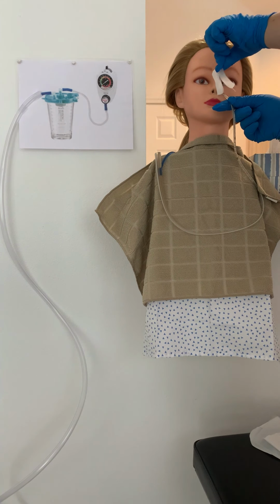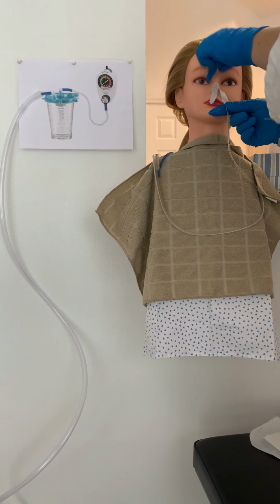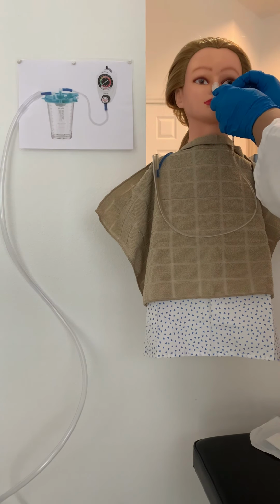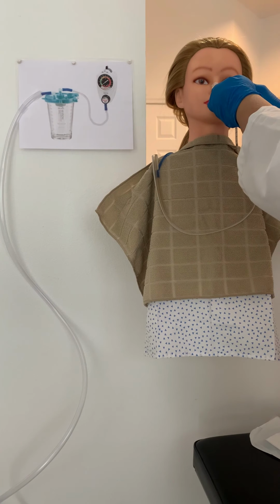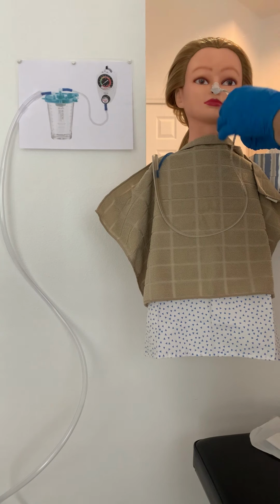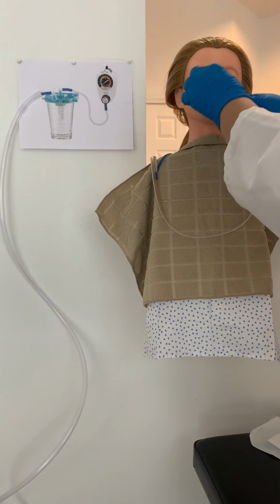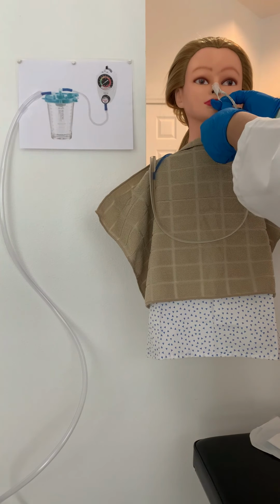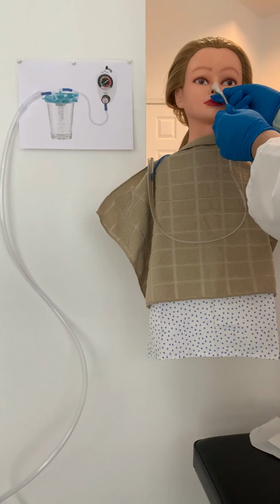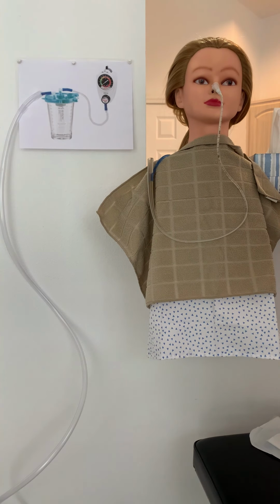Okay. Our new tape is going to secure. It's going to go on top of the nose, kind of over the bridge of the nose there, and then it's going to wrap around the tube like this. And then the next piece will also wrap around the tube, just like that. Okay, so that's being held secure.